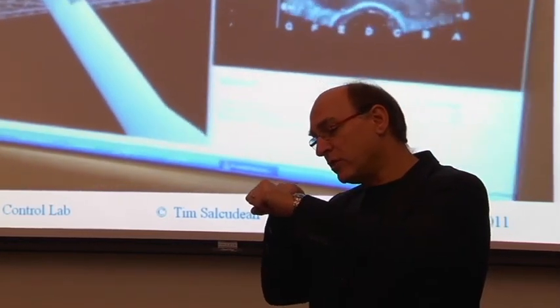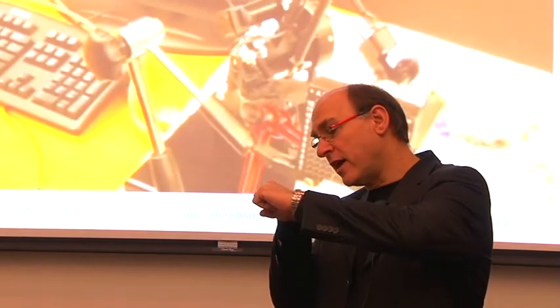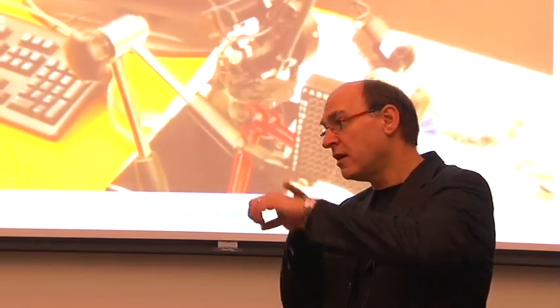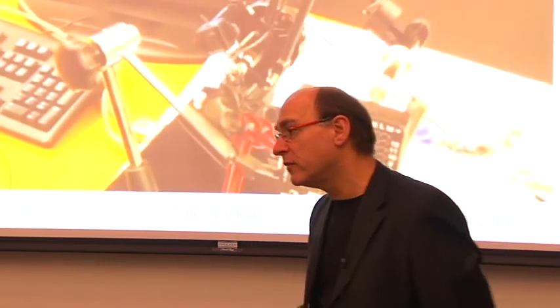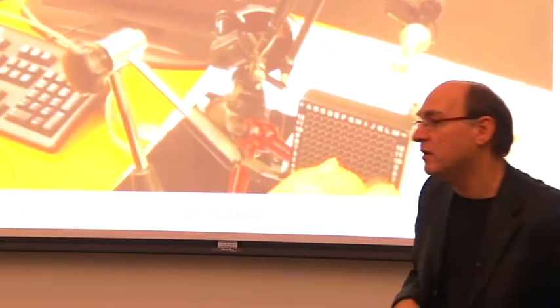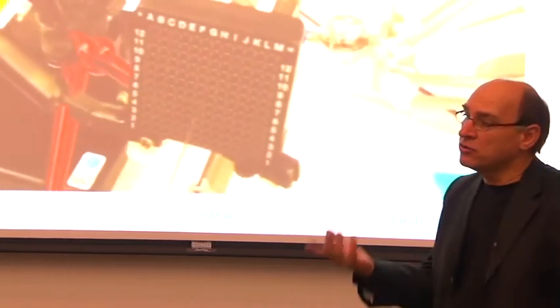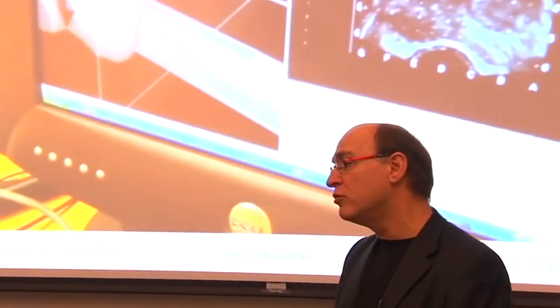The prostate deflects like this and like that when you insert the needle, which gives you this flare of the needles in the X-ray images, well known to radiation oncologists.